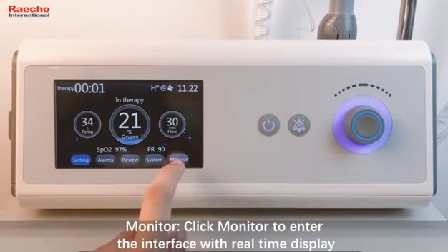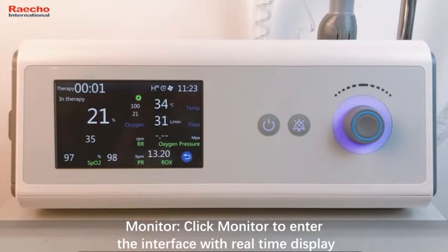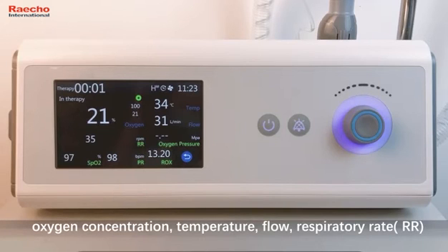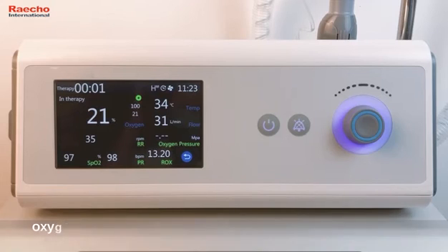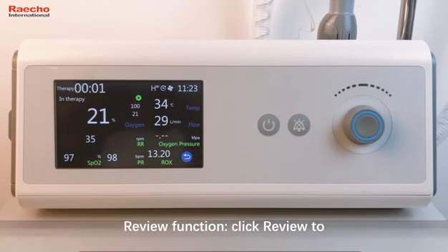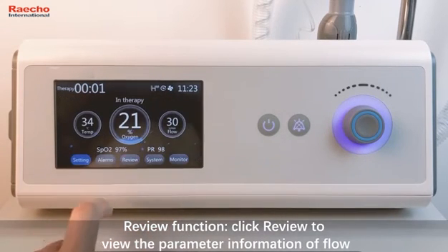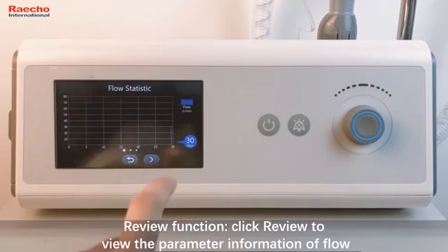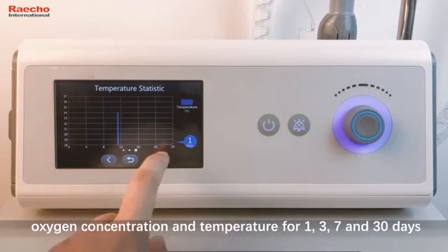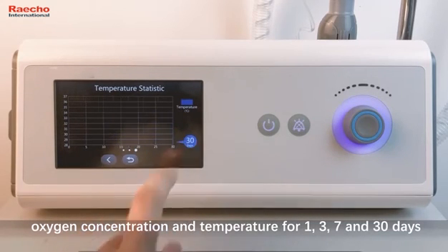Monitor. Click Monitor to enter the interface with the real-time display. Oxygen concentration, temperature, flow, respiratory rate, oxygen source pressure, oxygen saturation, pulse rate, ROX index. Review function. Click Review to view the parameter information of flow, oxygen concentration, and the temperature for 1, 3, 7, and 30 days.